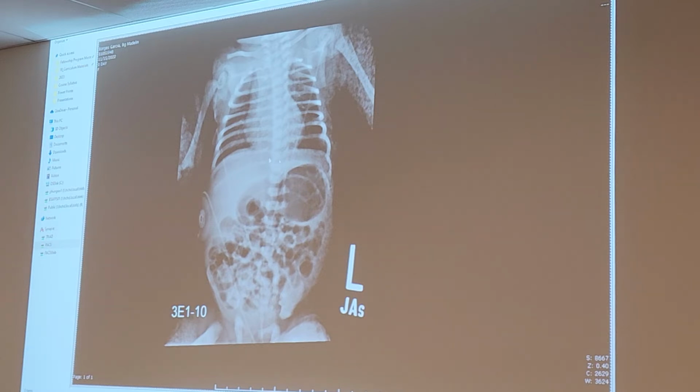Like, for example, between this white and this black, big jump. But here, between this white and this black, not as big of a jump. So here, my subject contrast is lower. Because my subject contrast is lower, that means overall my contrast is not going to be as big. The contrast is lower in the image.